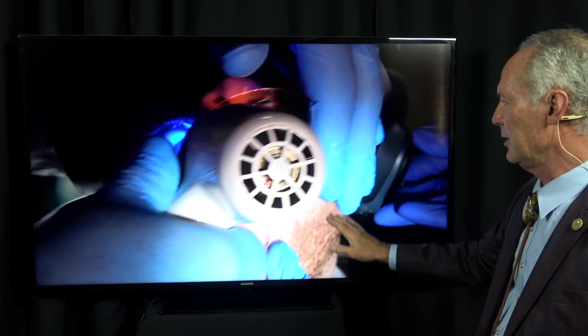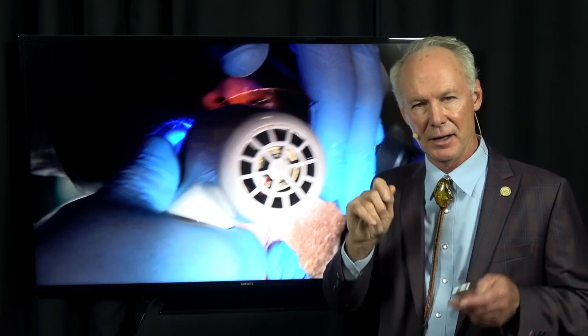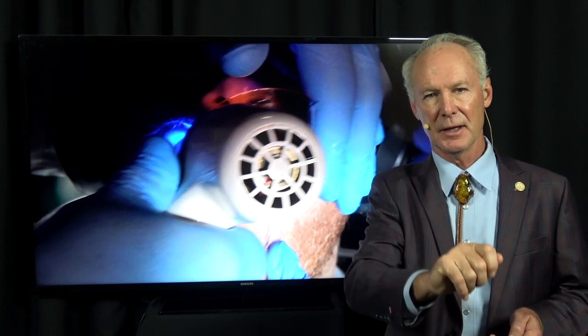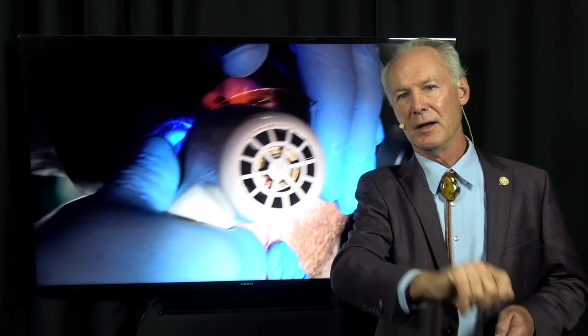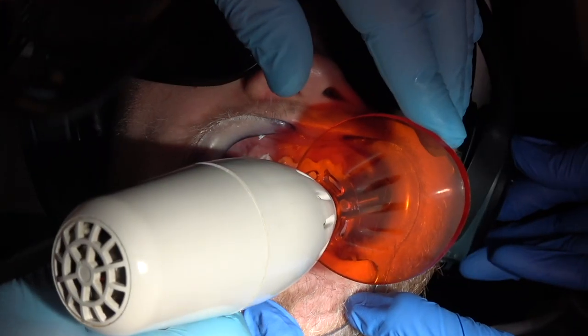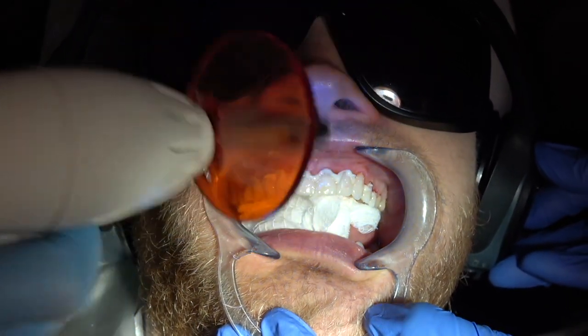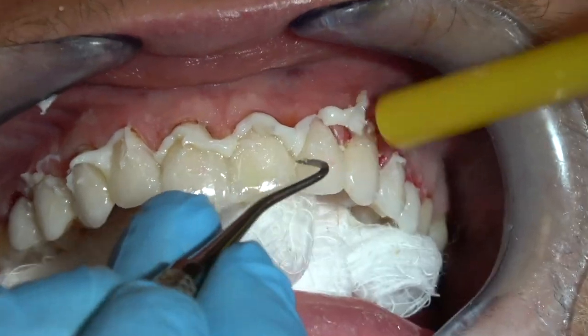Once I've seated all the veneers, I'm going to cure it initially with a curing light. Not all the way, but I'm going to hit the light on the palatal and go 1,001, 1,000, stop. Then I'm going to hit it on the facial, go 1,001, 1,000, stop. That fast will cure the veneers initially so you can peel off the excess luting composite. This is on the facial, just that little bit, and that's enough, and it'll peel right off.